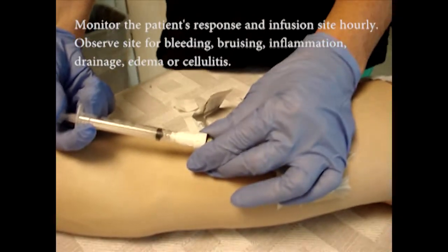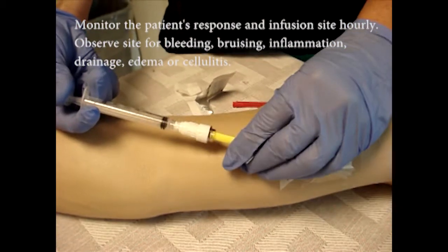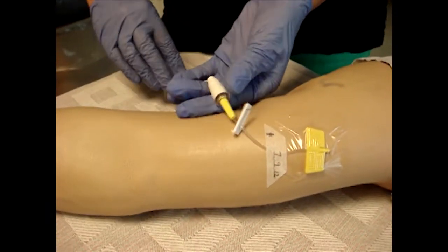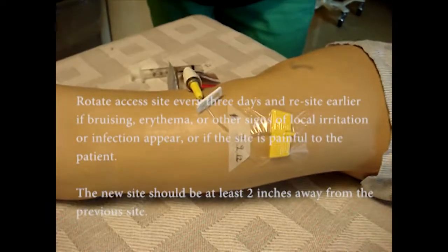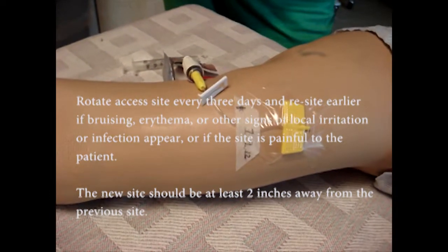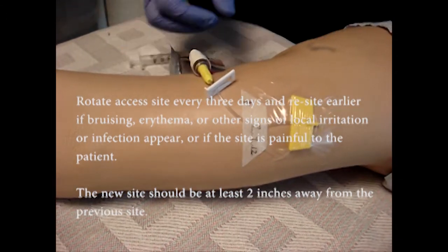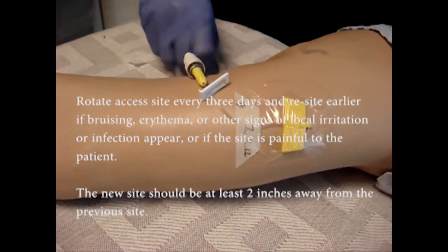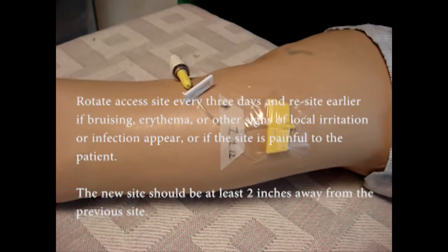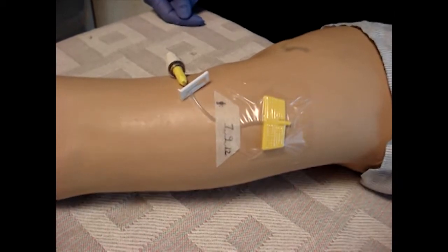Monitor the patient's response and infusion site hourly. Rotate the access site every three days, and re-site earlier if bruising, erythema, or other signs of local irritation or infection appear, or if the site is painful to the patient. Select a new site at least two inches from previous sites to facilitate fluid absorption and decrease evidence of adverse effects.